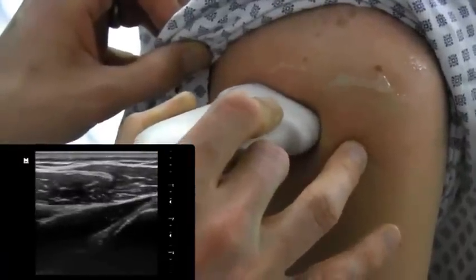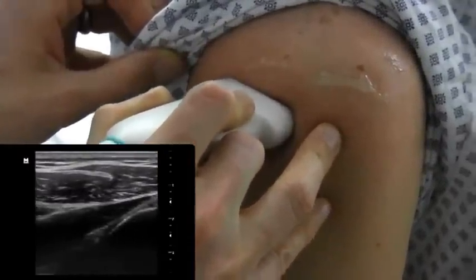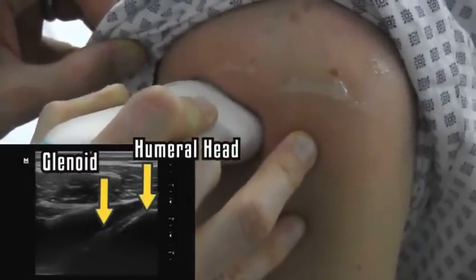Once you find both the glenoid and the humeral head on the screen at the same time, as you can see here, you're going to be able to assess for dislocation.